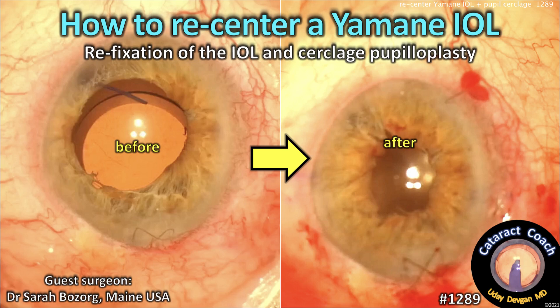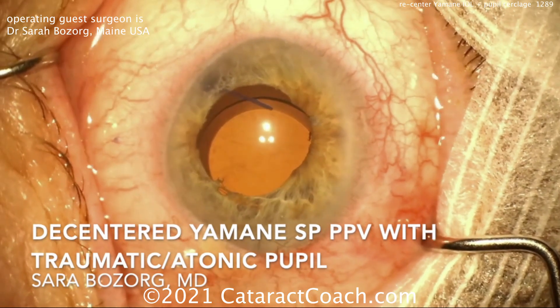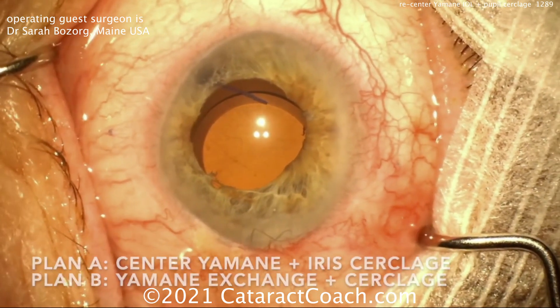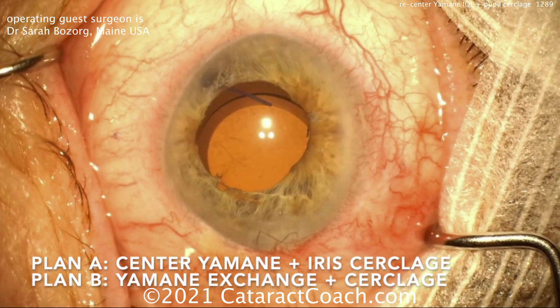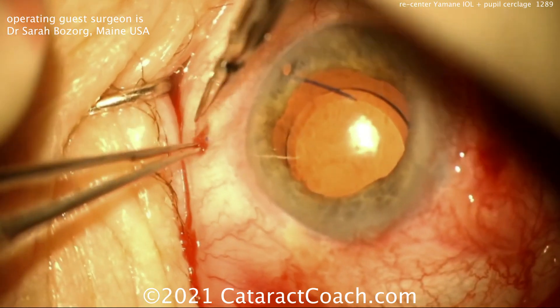This case involves refixation of the IOL and then a cerclage pupilloplasty. Our guest surgeon is Dr. Sarah Bozorg from Maine, USA. Here you can see a patient who had a Yamane already done and already had a full pars plana vitrectomy.